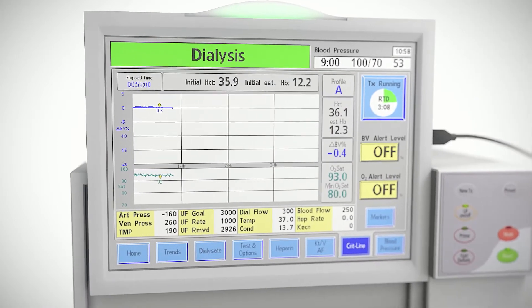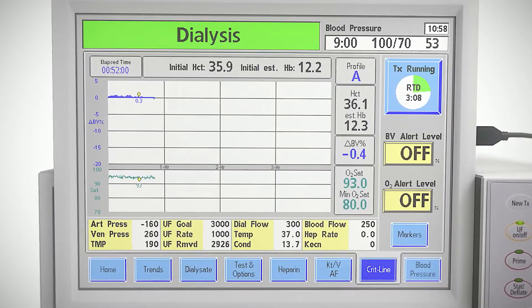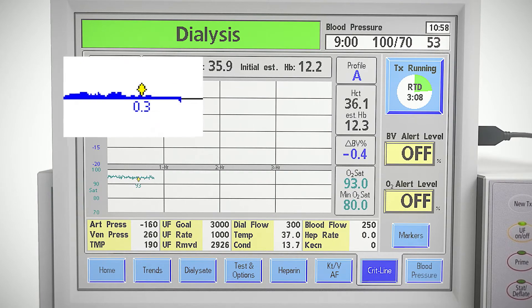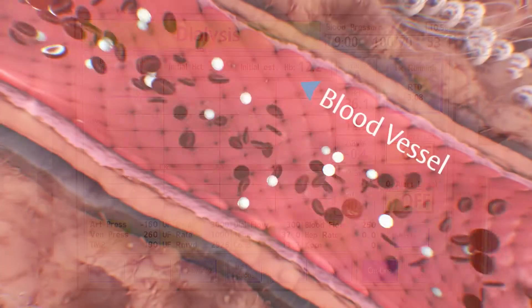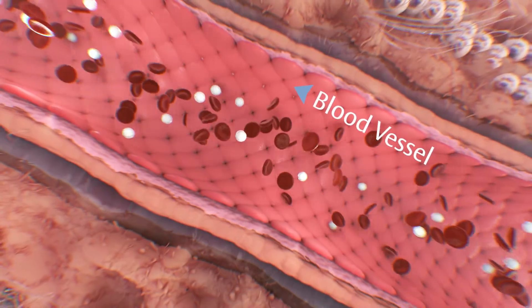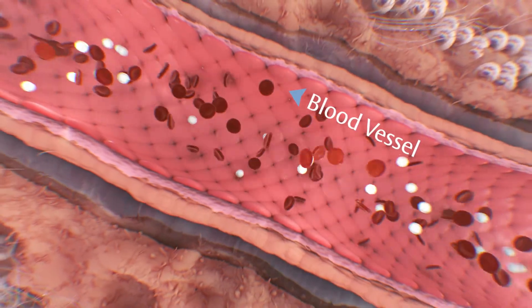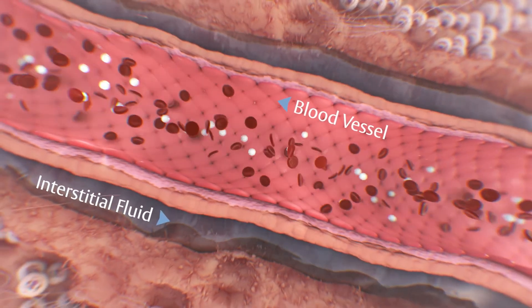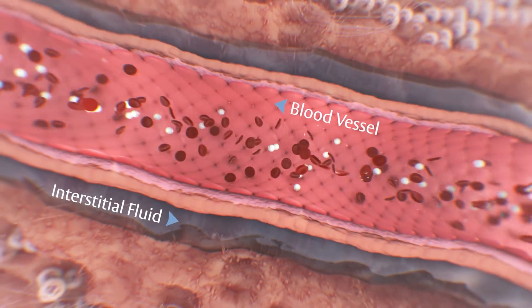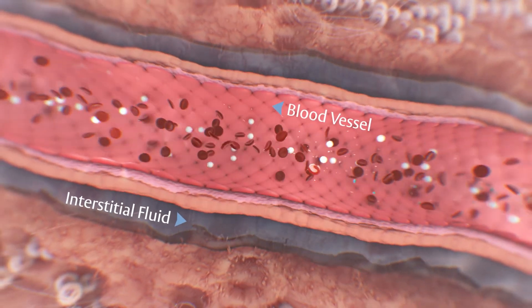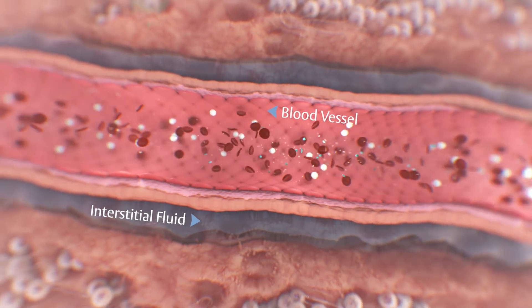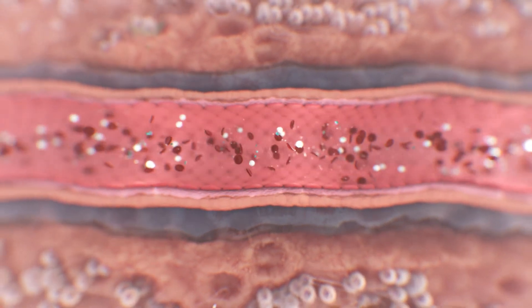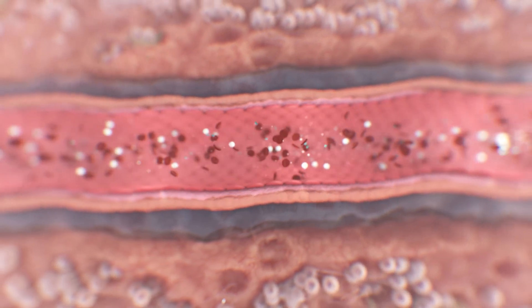Profile A is represented as a flat or slightly positive slope. This indicates that the patient's rate of plasma refill is the same as, or slightly greater than, the rate of ultrafiltration, suggesting that the ultrafiltration rate may be increased without the risk of immediate intradialytic symptoms.